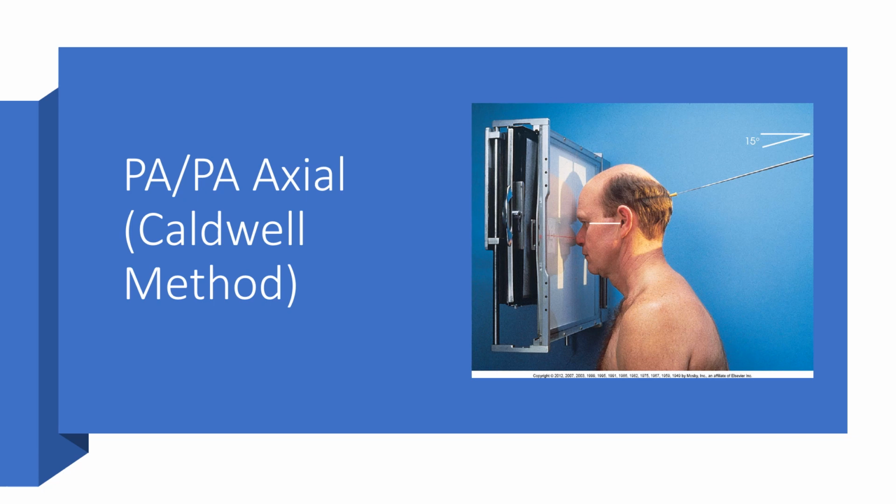Okay. All right. Anyway, center the nasion of the patient, that's the divot at the top of their nose, to your image receptor. Then put a 15-degree tube angle on your x-ray tube, 15 degrees caudad. Tip the patient's chin down slightly so that the orbitomeatal line intersects the image receptor at a perpendicular. That's what the white line is. Tube angle of 15 degrees caudad, and then achieve detent with your tube.